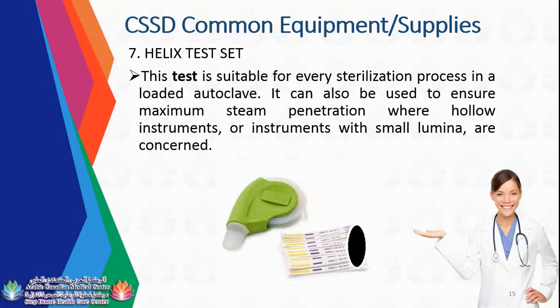Helix test set, this is your Helix test. Actually, your Helix test, guys, is the same steam penetration and air removal, but not for solid instruments, but for hollow or porous instruments. Porous means hollow instruments.